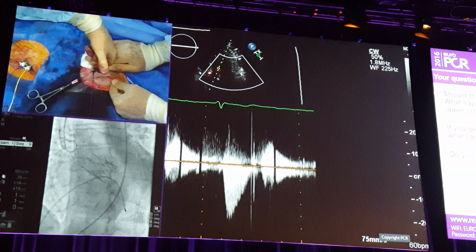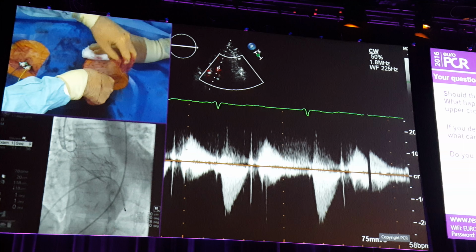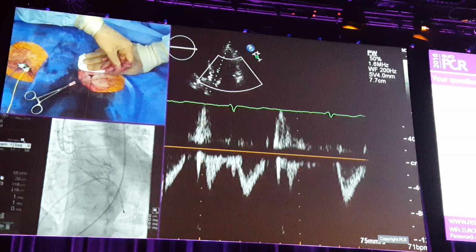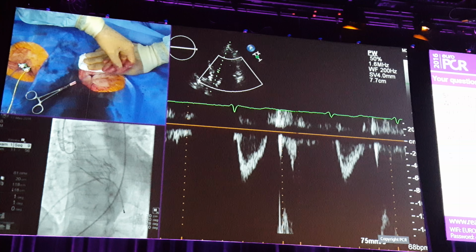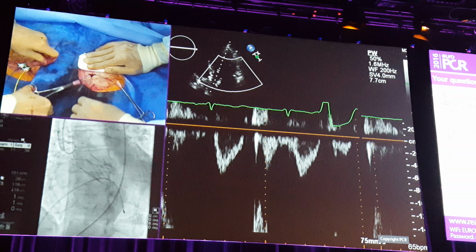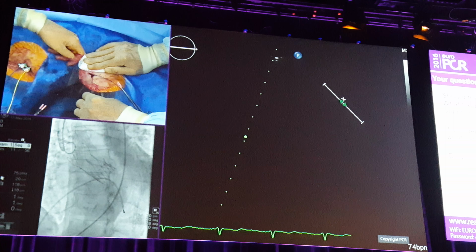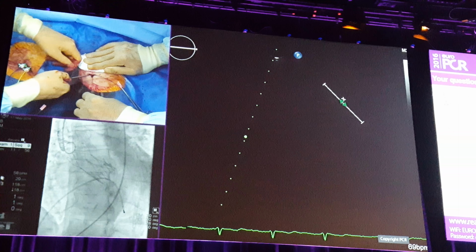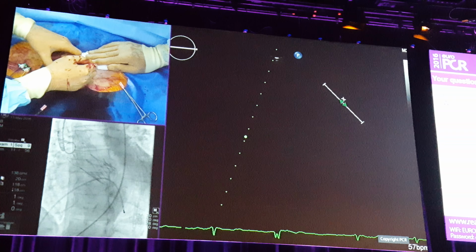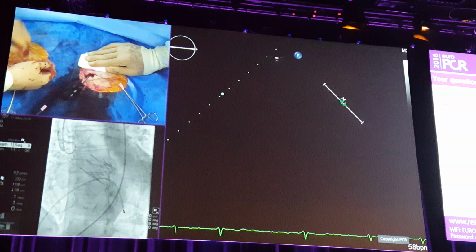Have you got any comments on that, Helga? I think the initial position is really crucial. Therefore, you should not start too deep, of course. And perhaps once you've completed your procedure, we can go back and see the implantation process once again, because everybody will appreciate that the system itself is very stable. There is no movement. And therefore, this problem does not really often occur that you're too deep or too high. This is only applicable to systems which are not as stable as the Symetis devices.